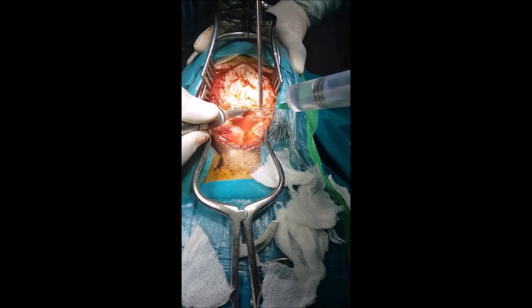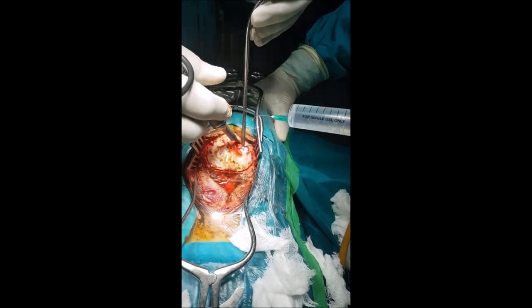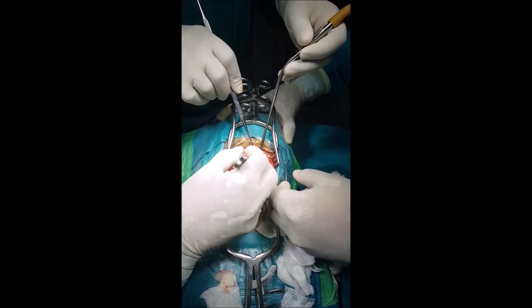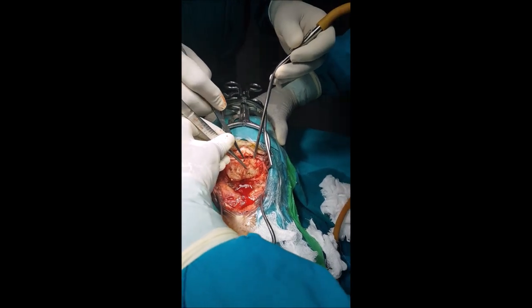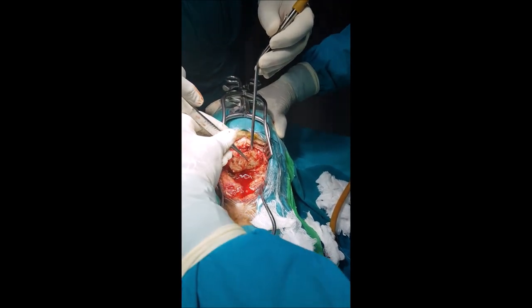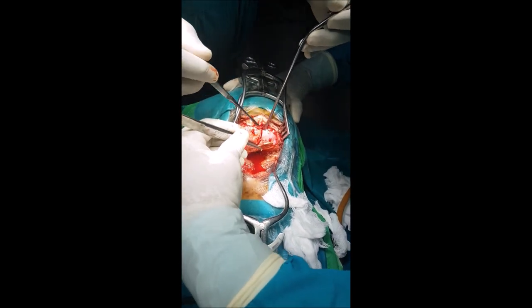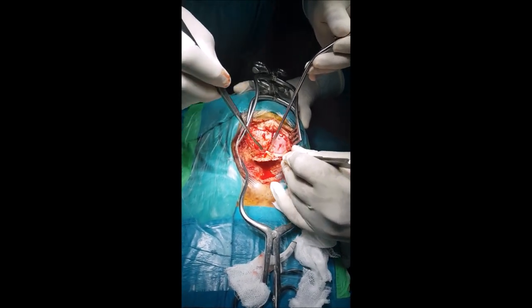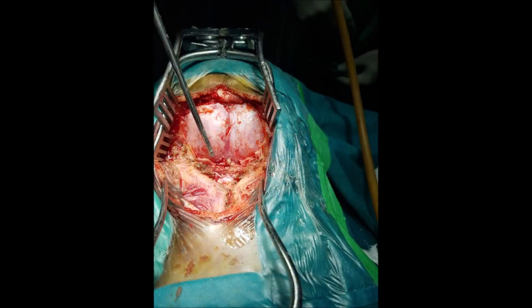We make two burr holes, one on each side just below the transverse sinus and confluence of venous sinuses — that is the torcula — and a wide bone flap is taken out in one piece as shown here in the video, exposing both the cerebellar hemispheres and midline. Dura is opened with the base towards the transverse sinus — that is the craniotomy.